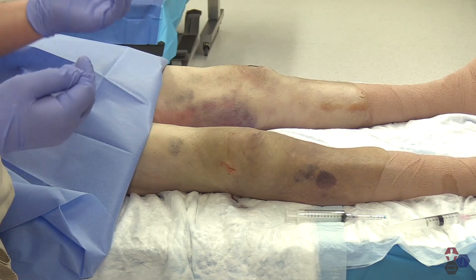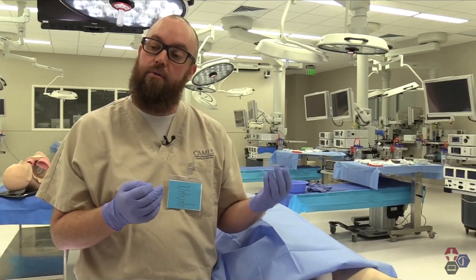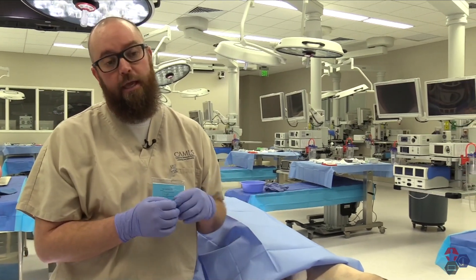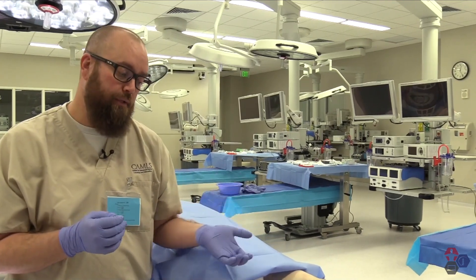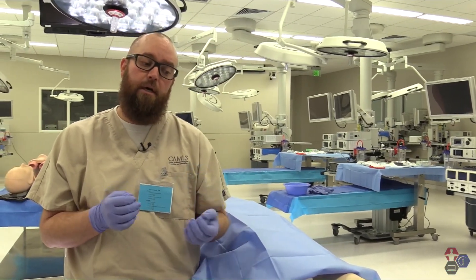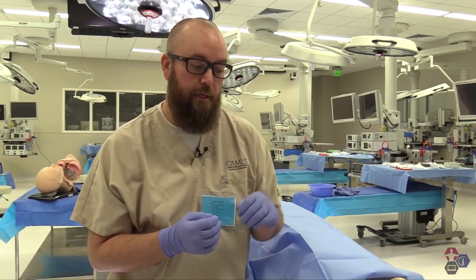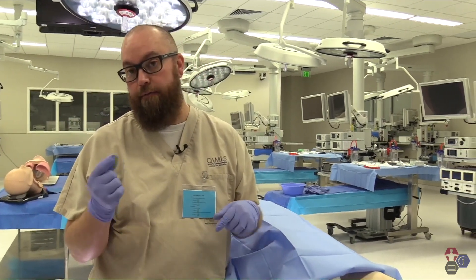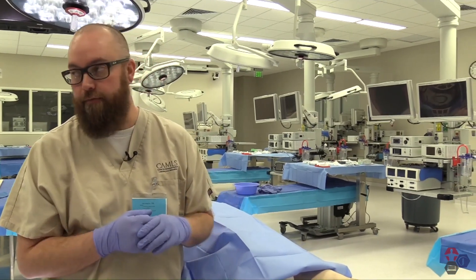It's an aseptic technique, so make sure to clean the surface, use a drape, sterile gloves, and local anesthesia. Remember not to go too deep because you don't want to alter the analysis of the synovial fluid in the joint. Depending on your desired outcome, you can either remove a small amount of fluid for analysis or take off a large volume for patient comfort.